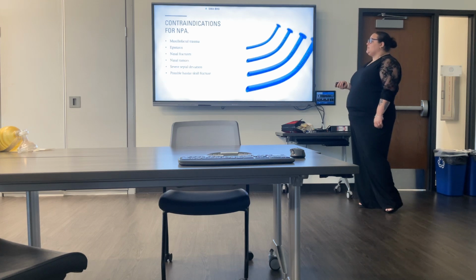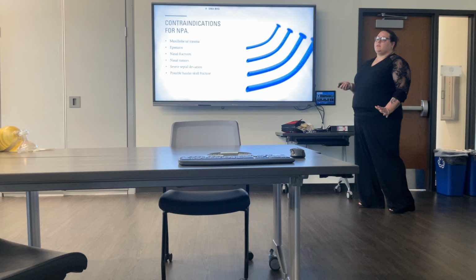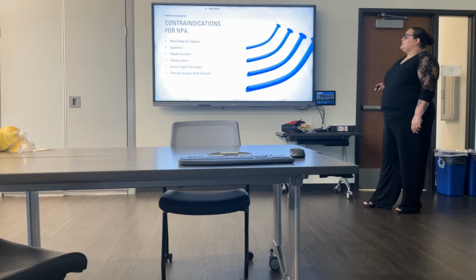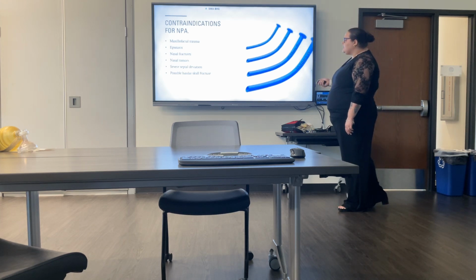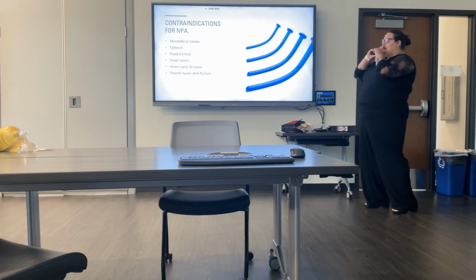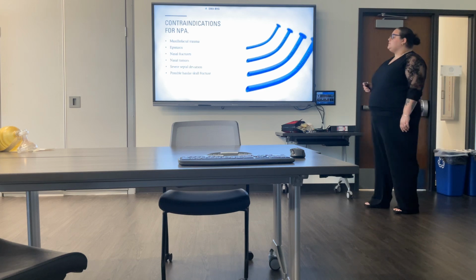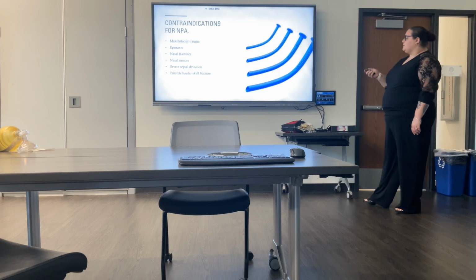You do not want to disturb it. You do not want to shift it or move it, because some tumors are actually very vascular and bleed. Severe septal deviation: the septum of your nose separates your right and your left naris. This is made of cartilage and is very soft and malleable. So instead of it being normally medially in line, their septum is deviated to one side or the other. This can make it difficult to facilitate NPA insertion.